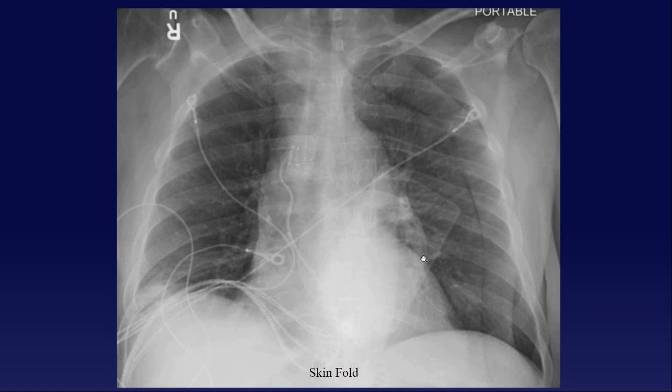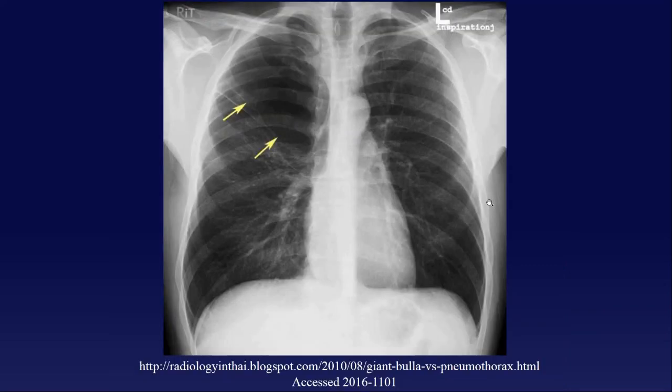So, be aware skin folds can occur. Those are the findings. And if you really can't figure it out, one, I say call radiology first. And two, if radiology can't figure it out either, just get another portable. It's quick, it's easy, and it should answer the question.